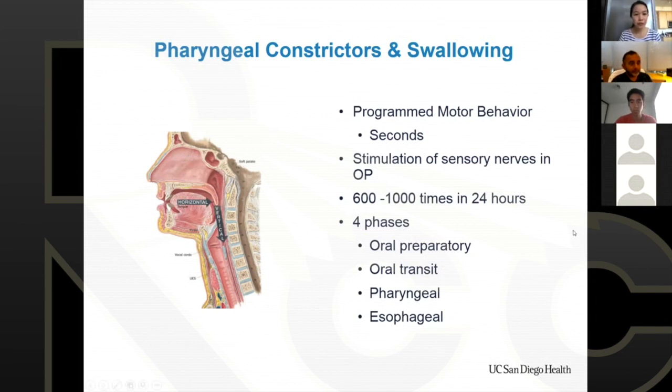Also, Dr. Sangvhi, there's another question for the parotid. Some institutions only contour the superficial lobe, and you showed in your lecture that it's important to include the deep lobe for computation. So what is the implication of that? So that's the mean dose. If you look at some of the early RT trials, the contouring guidelines only really contoured the superficial lobe of the parotid gland and did not include the deep lobe, out of recognition that when you treat level 2 nodes, the deep lobe is usually abutting where you're treating those level 2 nodes.